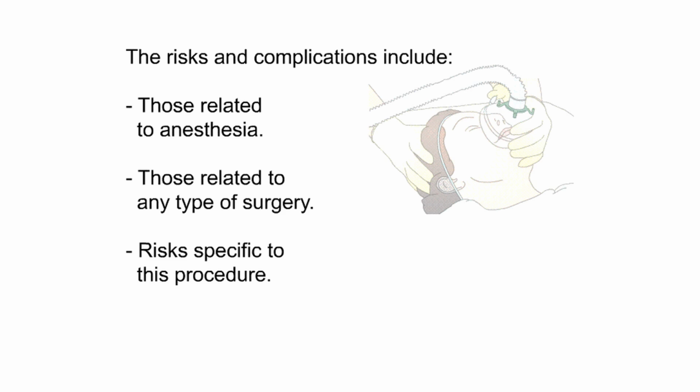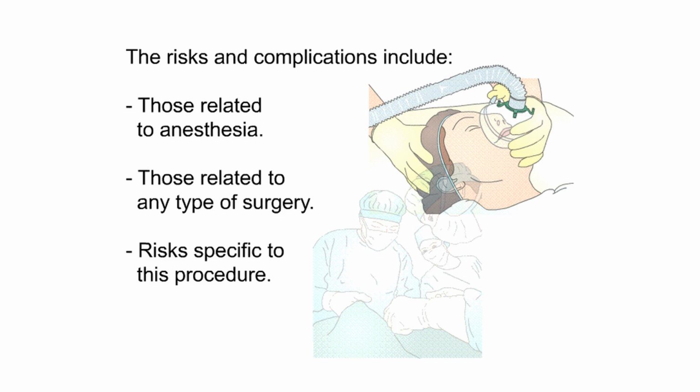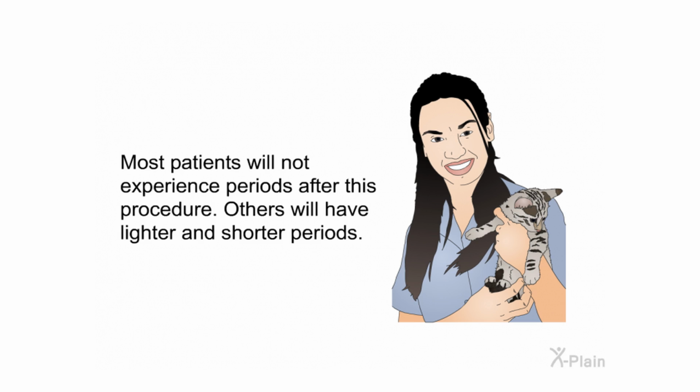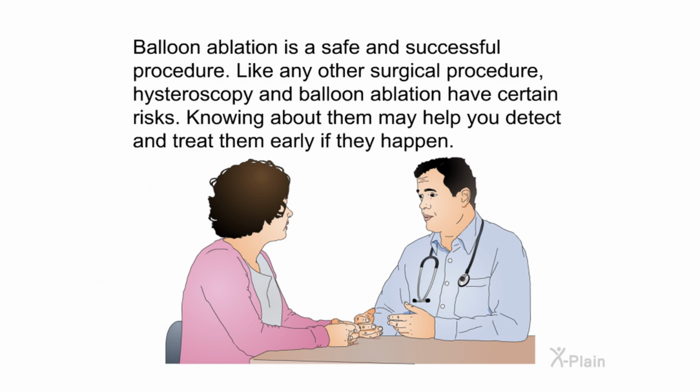The risks and complications include those related to anesthesia, those related to any type of surgery, and risks specific to this procedure. Most patients will not experience periods after this procedure. Others will have lighter and shorter periods. Balloon ablation is a safe and successful procedure. Like any other surgical procedure, hysteroscopy and balloon ablation have certain risks. Knowing about them may help you detect and treat them early if they happen.